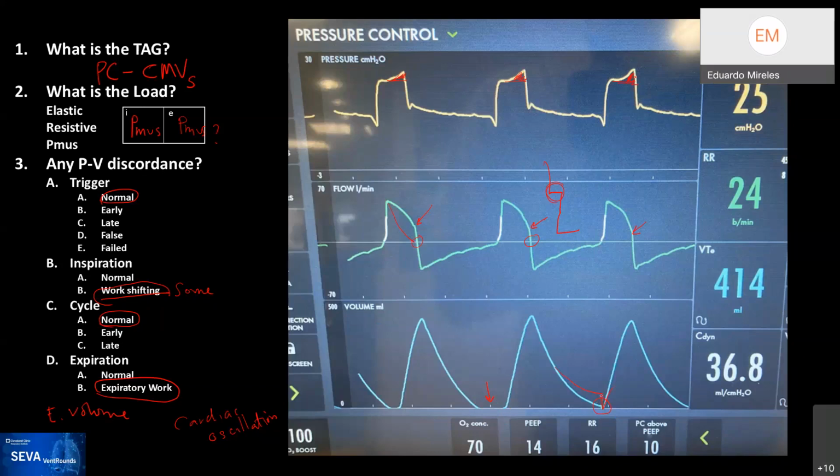And remember that can be a leak, or it could be just that the patient triggered a breath earlier, right? And so there's a little bit of air trapping during that next breath. But a common misconception is to think that if you have auto PEEP, in all the breaths you're going to have that increase, that difference in inspiratory and expiratory. That just happens at times, not continuously. Then you equilibrate and you can have auto PEEP without that delta.